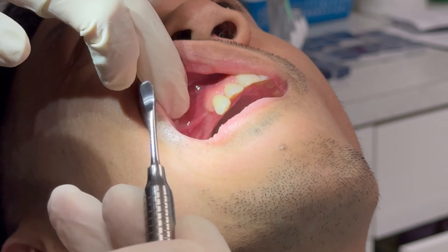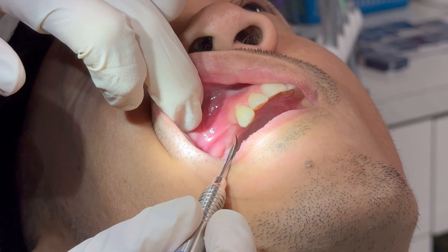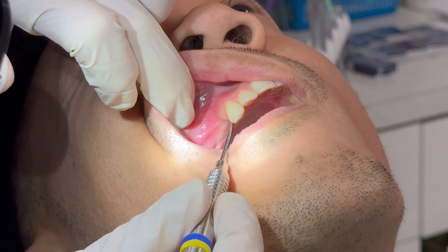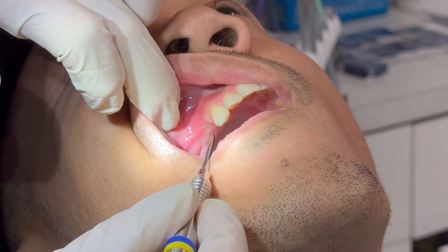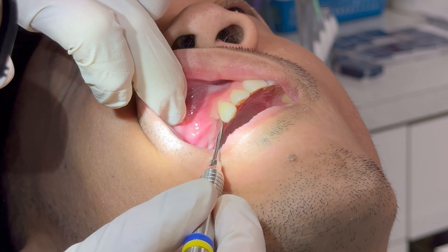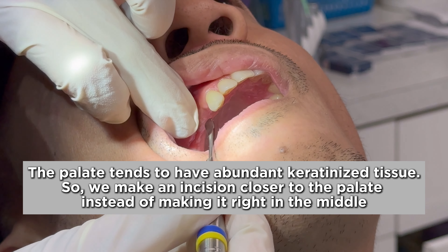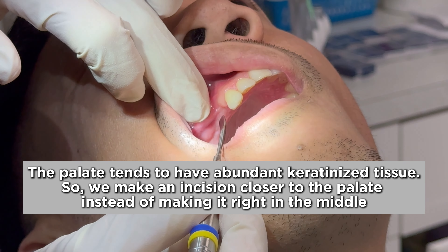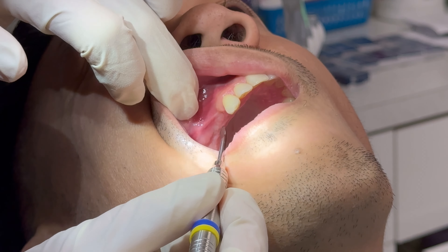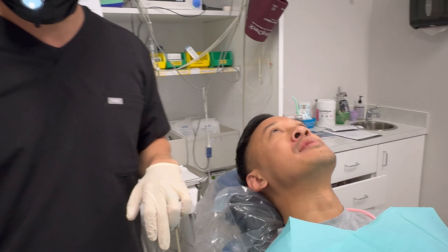So when I'm doing this implant uncovering, when I'm getting to these implants and putting those healing abutments on, I want to be very careful and make sure that his remaining keratinized gingiva — which starts right here — that I don't just randomly make an incision where I want to. I need to make the incision further over here so I can pull that gum over further in this direction. That's going to be a lot more helpful in his future when we put those crowns on. Whenever we do these implant uncoverings, we've got to be thinking about how much keratinized gingiva there is and make sure we pull it in the right direction.